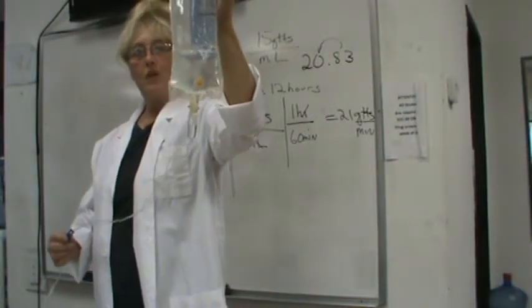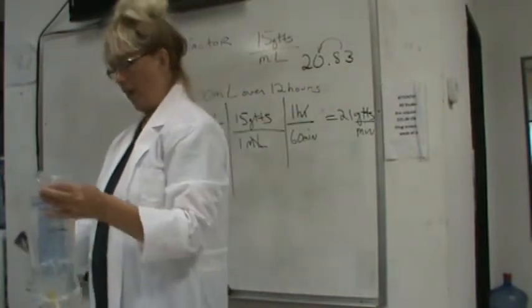Okay, so I want you to count till you get 21 drops.